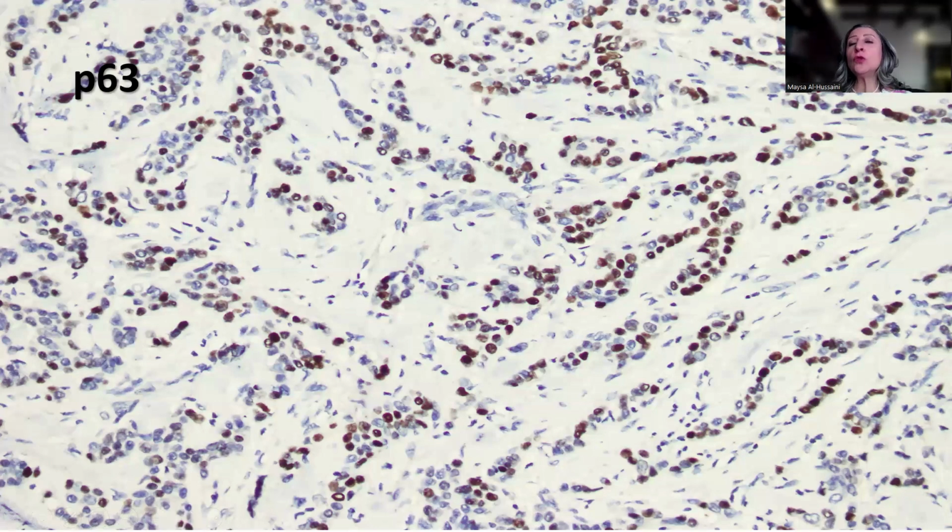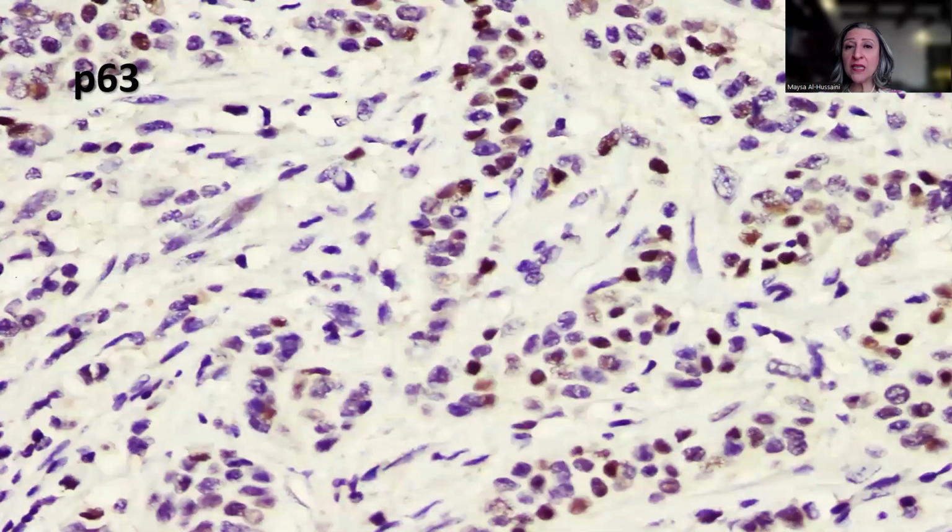So if you are not aware of this potential pitfall, you might end up calling the whole lesion as benign sclerosing adenosis with some ductal carcinoma in situ because of the wrong interpretation of P63. How would I really ensure that I do not commit such a mistake? Because there are no two components, the same tumor cells that are forming the malignant glands are the ones that are labeling positively with P63.